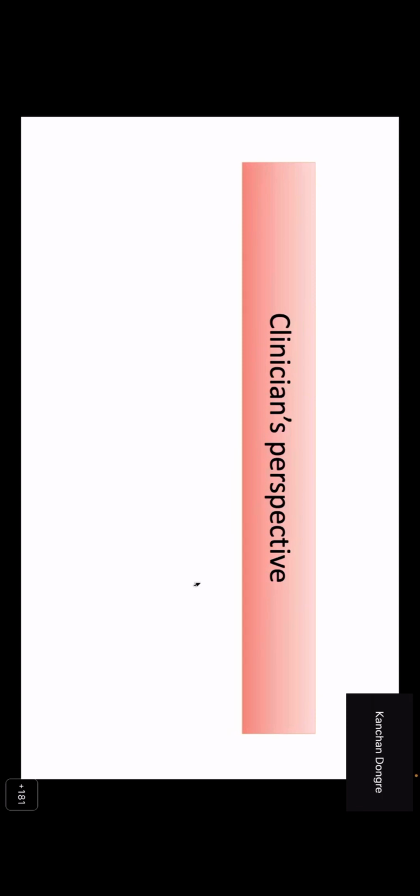And the next question is, with occasional normoblasts and neutrophils with shift to left, can we say leukoerythroblastic blood picture? Yes, you still say that, because it is still a leukoerythroblastic picture, with immature cells. The term does not designate a high count or a low count in itself. Traditionally it is associated with a higher count with a lot of cells, but you see these immature cells in a low count also. It's still a leukoerythroblastic picture.